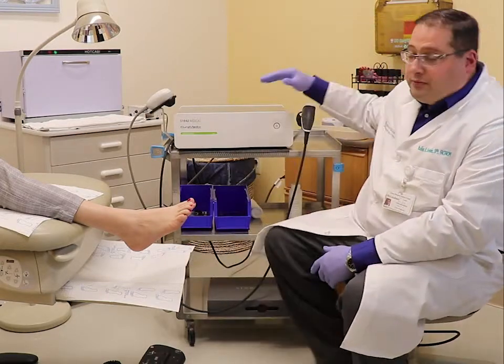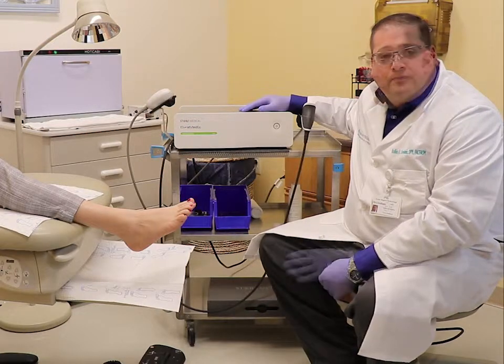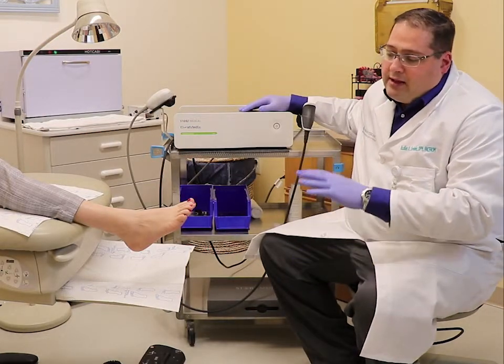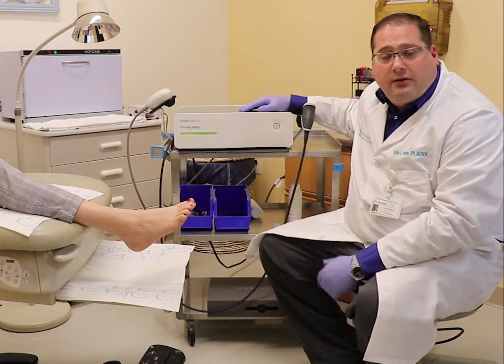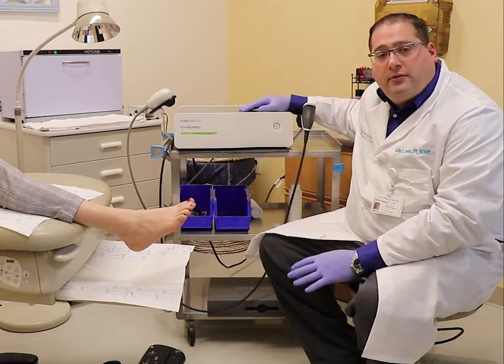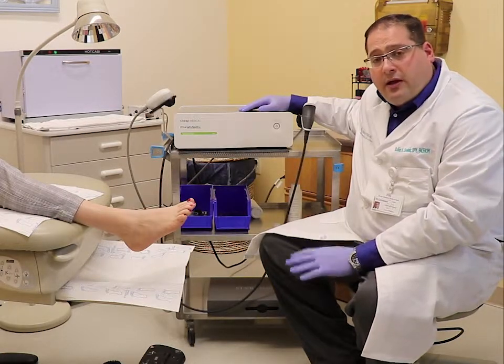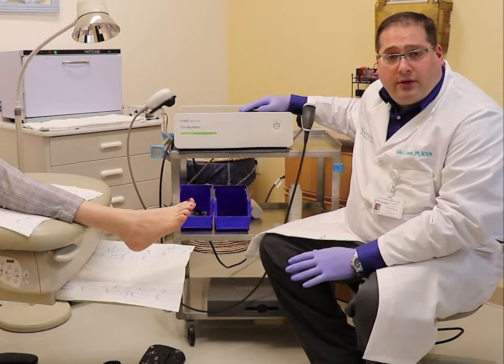The machine is right here. This is from Curamedics. It is a lithotripsy-type machine. What happens is we apply sound waves to the bottom of a painful foot or the back of a heel. This sound wave causes subclinical trauma to the plantar fascia — it traumatizes it, but not to the point where it's clinically noted, so there's no pain with this.